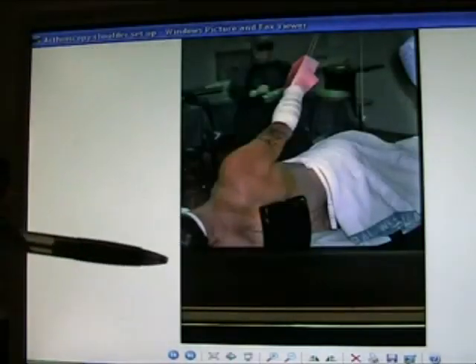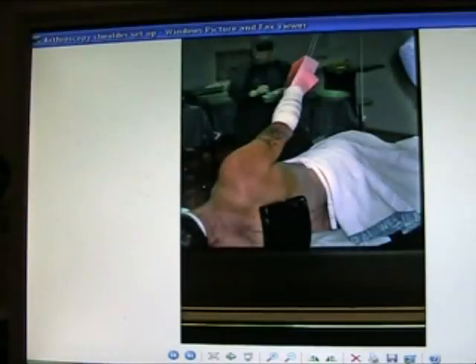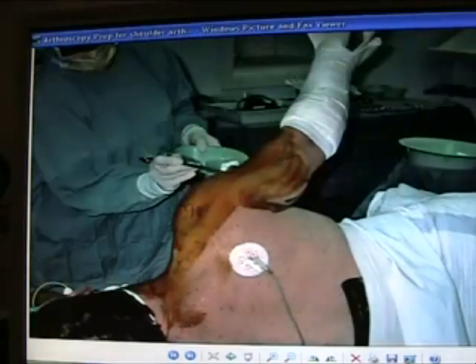Here is an acromial spur. Here is an arm traction setup for an arthroscopy of the shoulder or subacromial bursectomy.